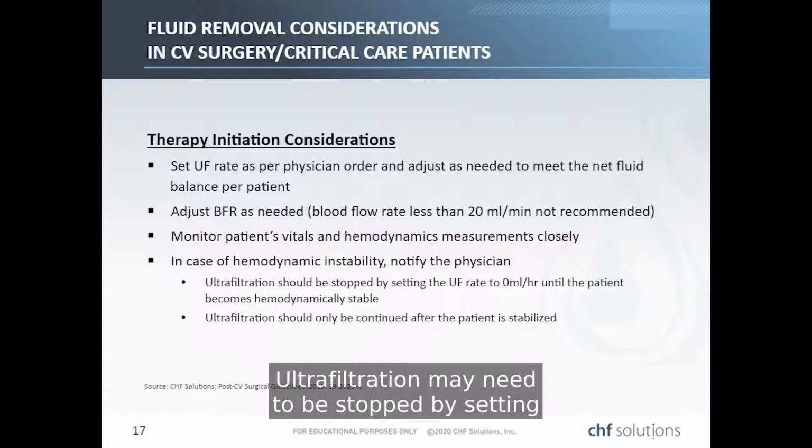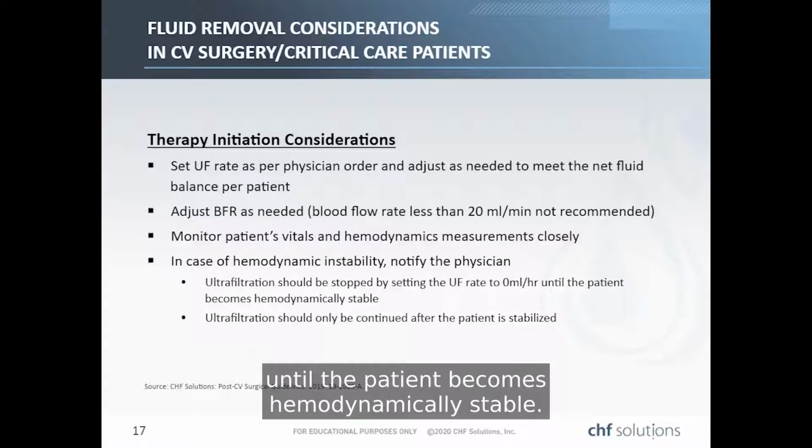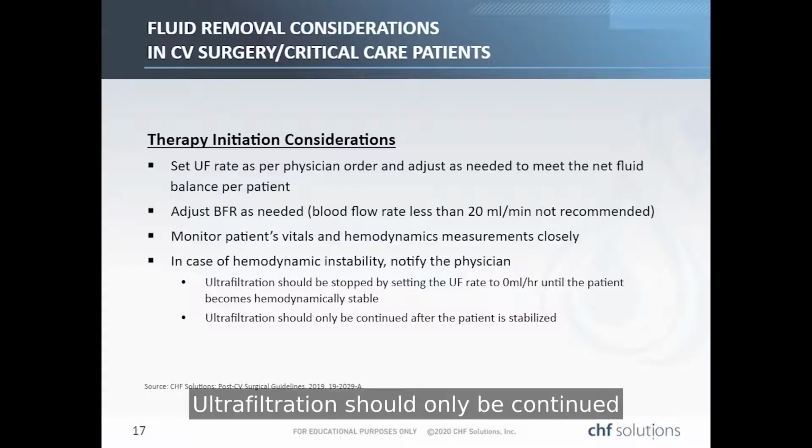Ultrafiltration may need to be stopped by setting the UF rate to 0 until the patient becomes hemodynamically stable. Ultrafiltration should only be continued after the patient has been stabilized.